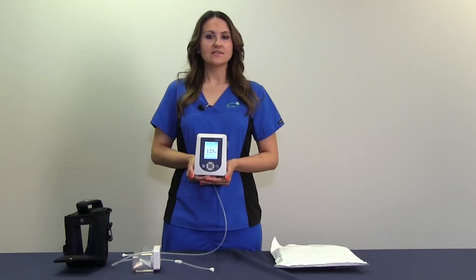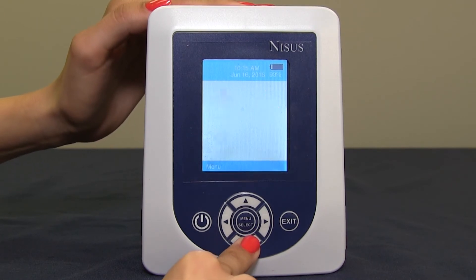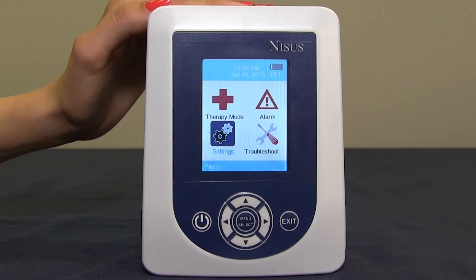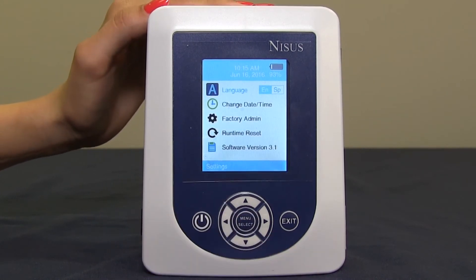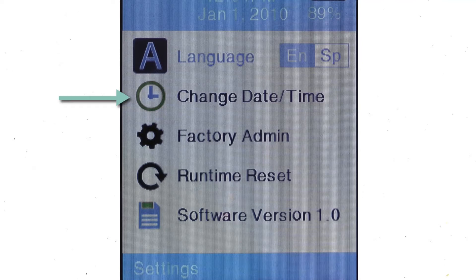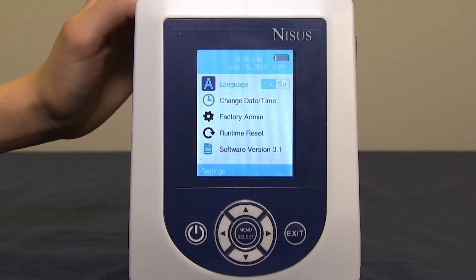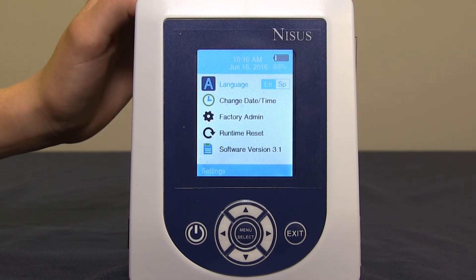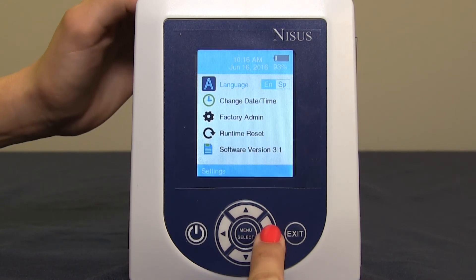In order to access the settings, locate menu select, and arrow down to highlight settings. Once highlighted, press menu select. Here you will see language, change date and time, factory admin, runtime reset, and software version. In order to change the language from English to Spanish, make sure language is highlighted. Once highlighted, arrow over to highlight Spanish.